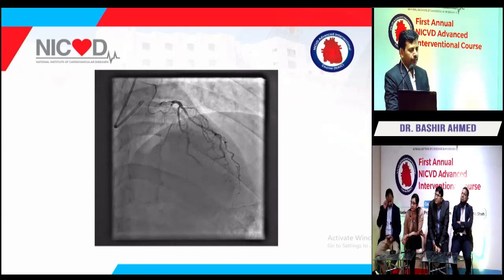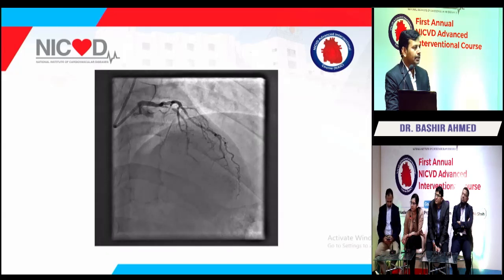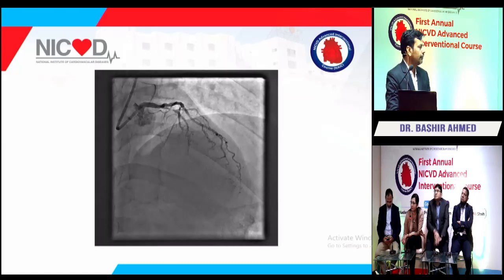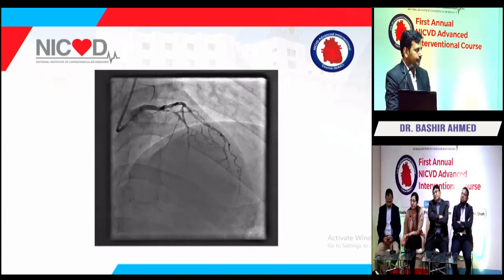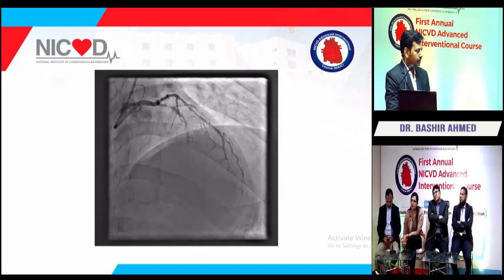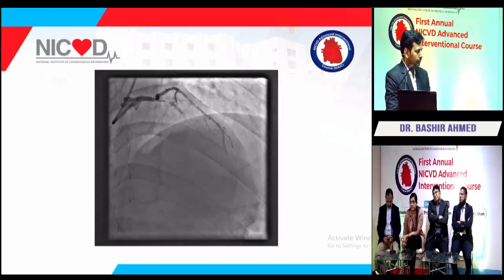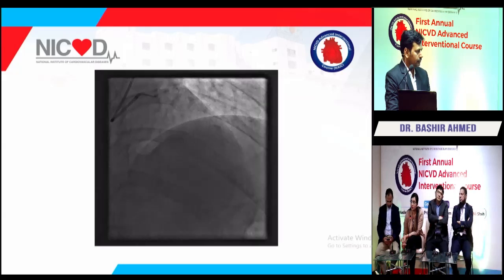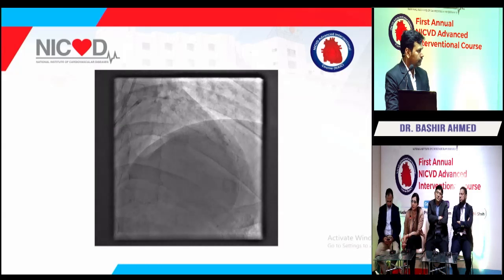If we are planning for atherectomy devices, what are the coronary lesions for which there's an indication for rotational or orbital atherectomy device? For rotational atherectomy: a failed PCI with balloon dilatation, an uncrossable lesion, or an undilatable lesion, where you could cross the balloon down in the lesion but it did not yield well. Those are the cases in which, unless there are any contraindications, you would consider doing a rotational atherectomy.